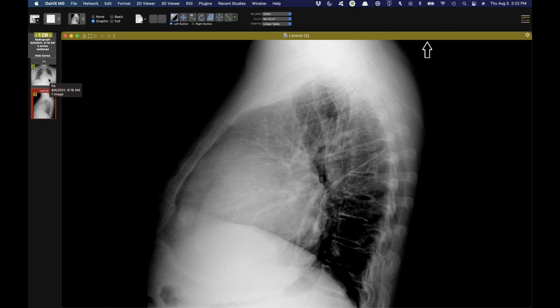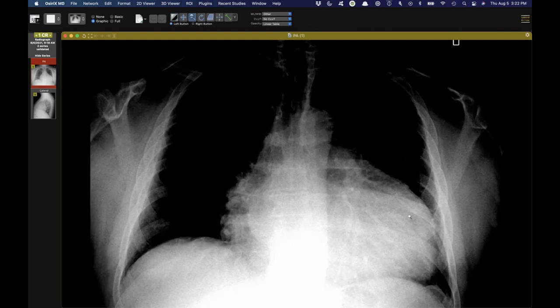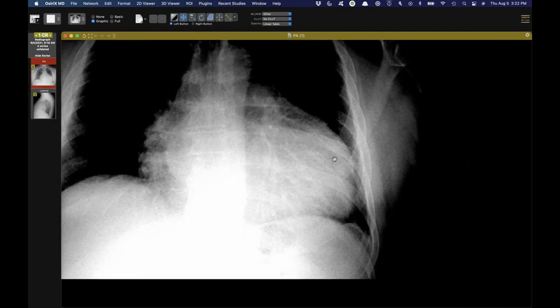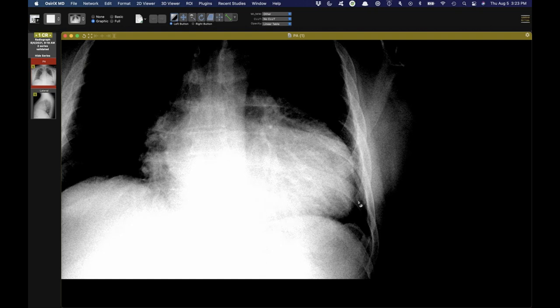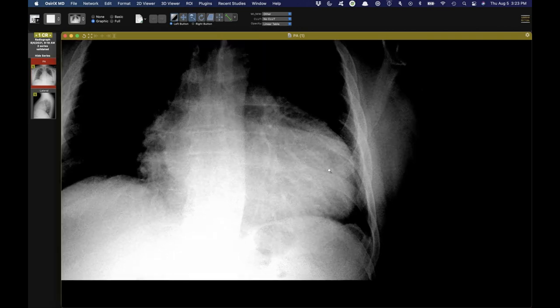And I know, Howard, you've pointed out multiple times other findings that you can see with pericardial effusion, and I noticed it in this one here, which is the similar fat pad sign on the PA radiograph. Now, does this have a separate name other than just a fat pad sign on the frontal radiograph or not? Yeah, I think it might be just called the epicardial fat sign of pericardial effusion. And it's really unusual because you have to have just the right amount of fat and catch it in profile, in tangent. Yes.